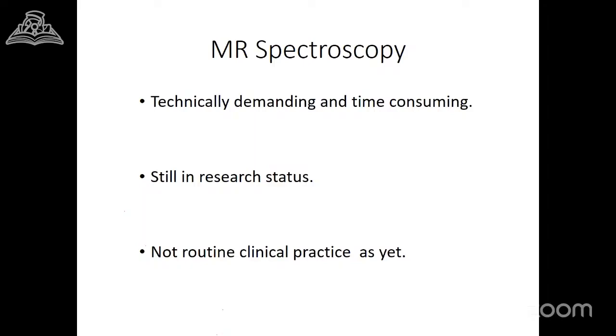MR spectroscopy is technically demanding and time-consuming compared to other MRI techniques. It is still mainly considered a research tool and has not yet become part of our routine clinical practice. For this reason, it is not widely used in everyday prostate cancer imaging at present.